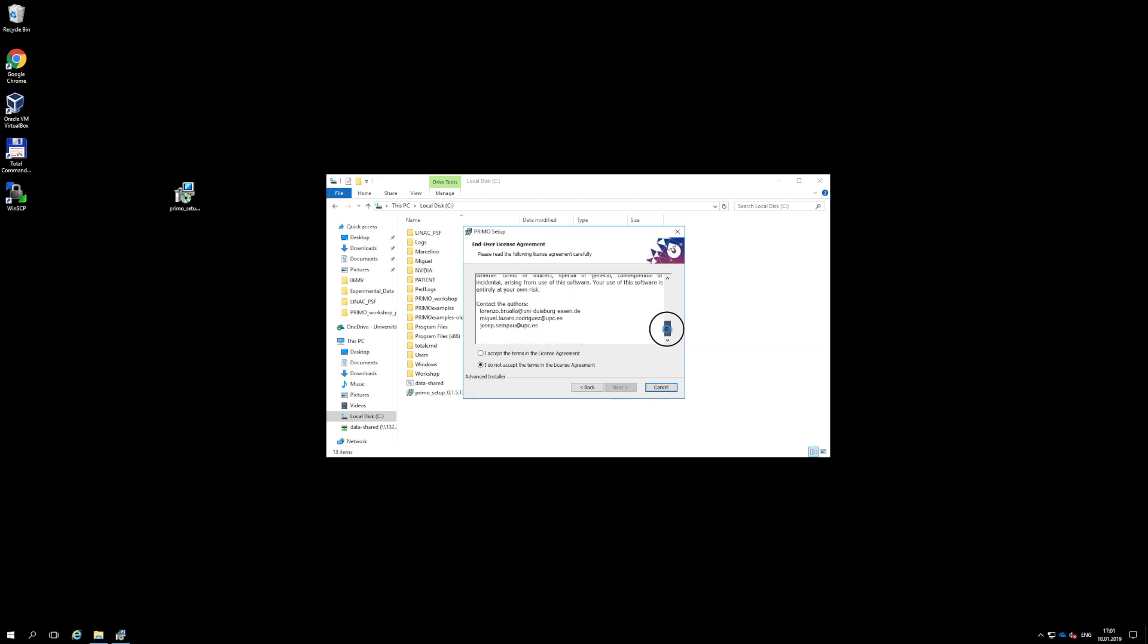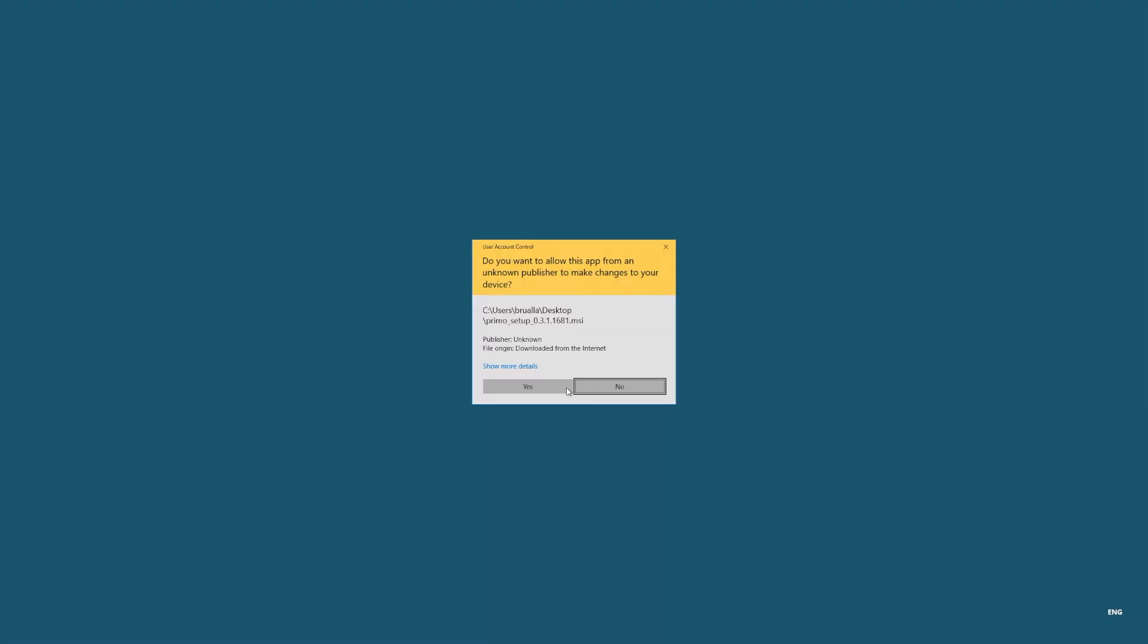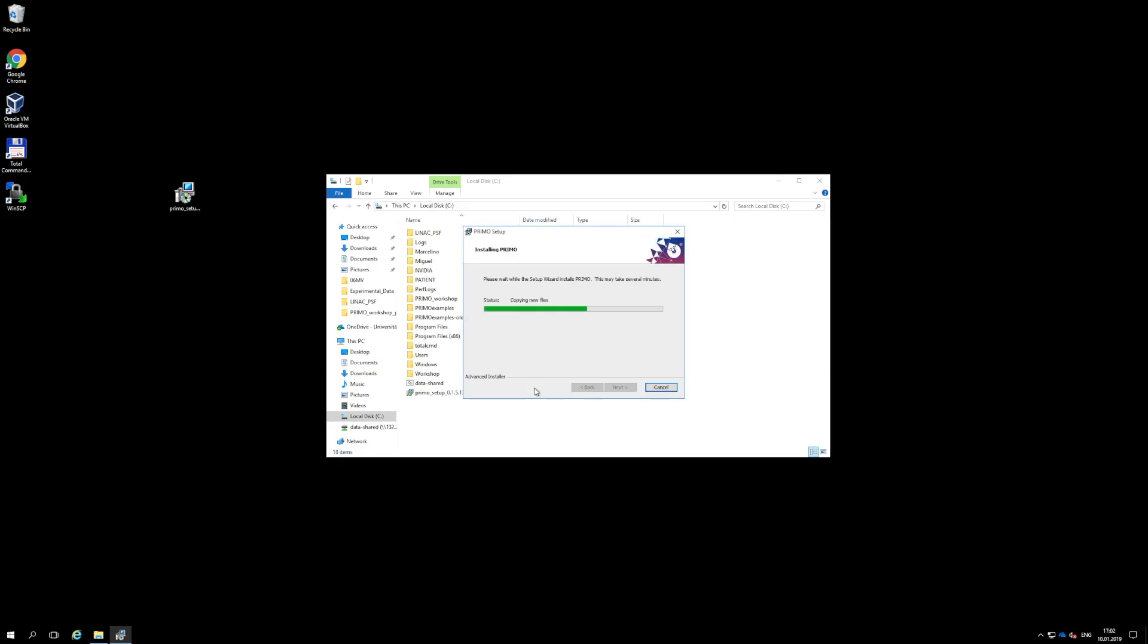You will be required to accept the copyright and disclaimer agreement and the software will be installed in the directory you have chosen. The default directory is c colon backslash Primo. We suggest that you keep that default directory.